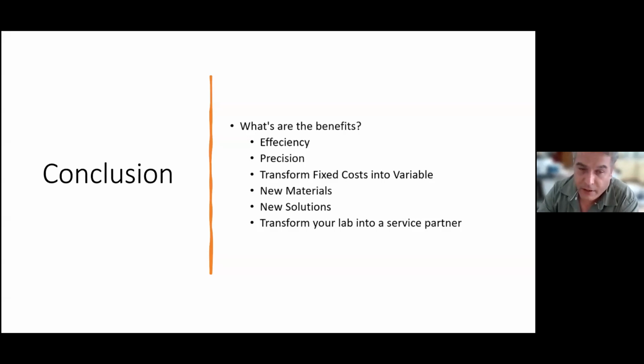So if any of your manual process can be substituted by the digital way, what will it be? You can gain efficiency because your equipment is precisely calibrated. For example, this morning I made a coping in wax.